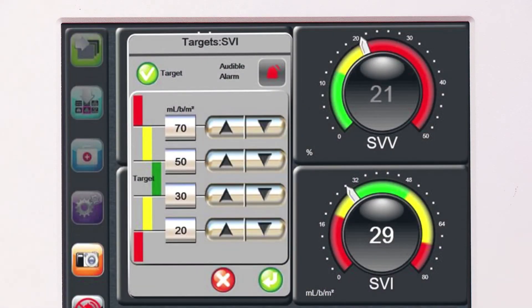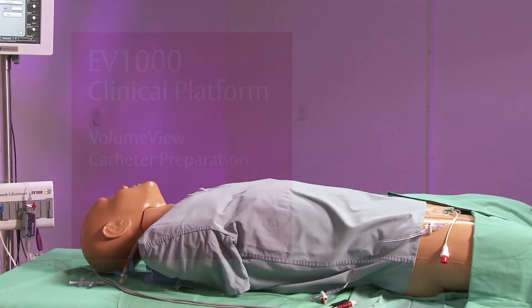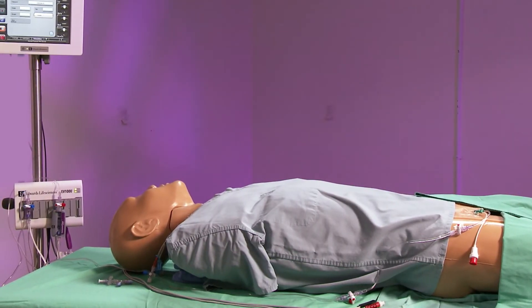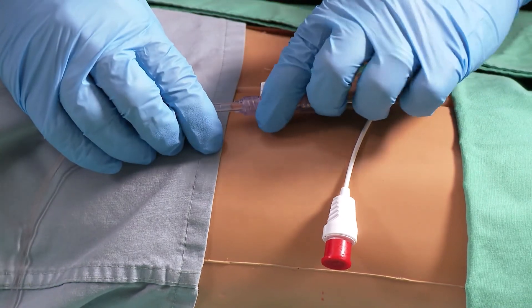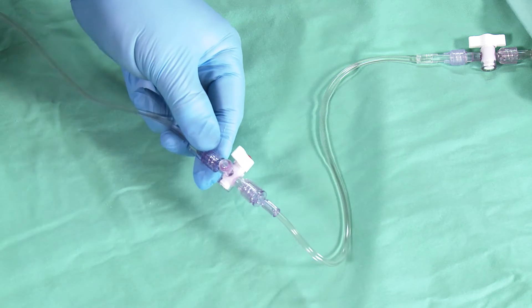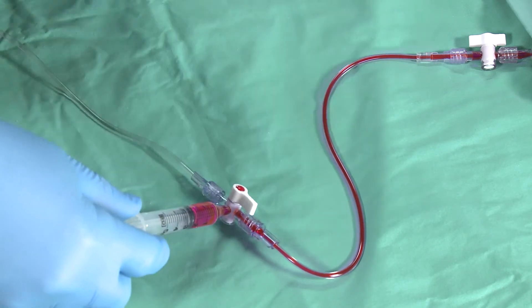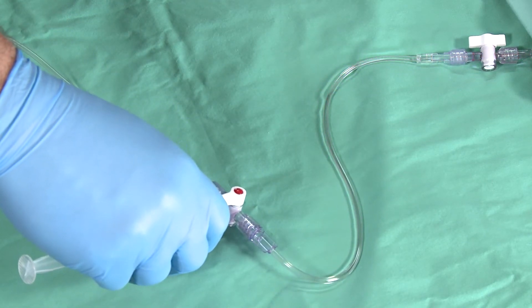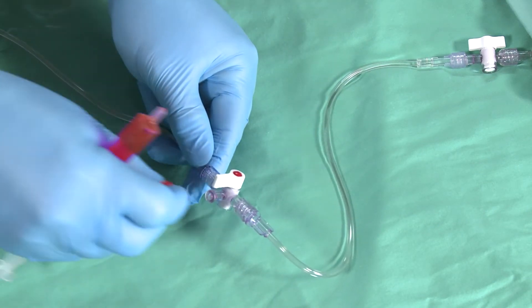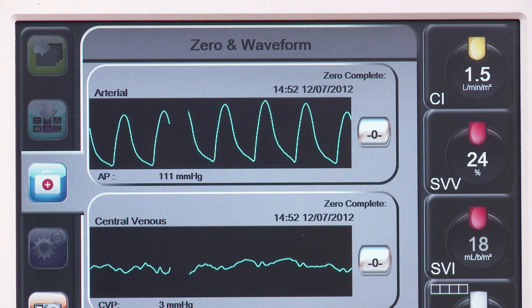Set the blood pressure alarms on the bedside monitor as well as the displayed parameters on the EV1000 clinical platform. Volume view catheter preparation. After the volume view femoral arterial catheter is inserted and the volume view sensor is set up, connect the volume view sensor's pressure tubing to the volume view catheter. Aspirate and flush the line with a syringe, removing any residual air before flushing residual blood to the patient. Confirm that the appropriate arterial pressure tracing and reading is on the EV1000 clinical platform and the bedside monitor.